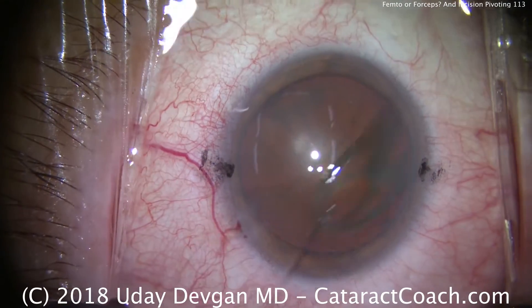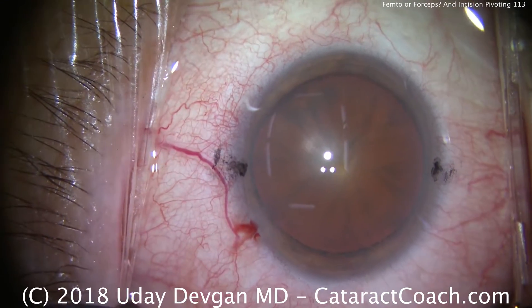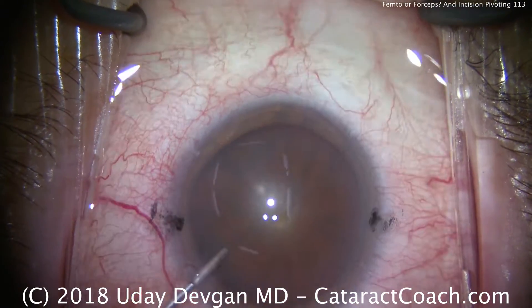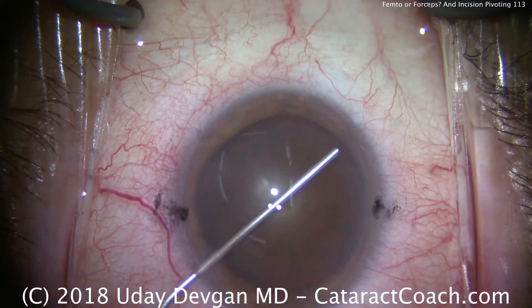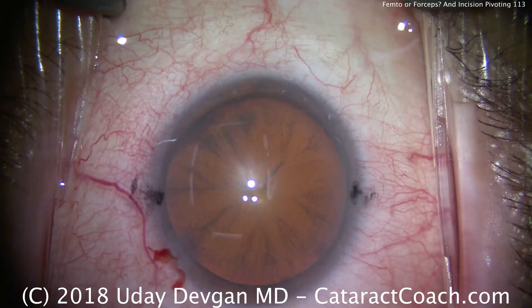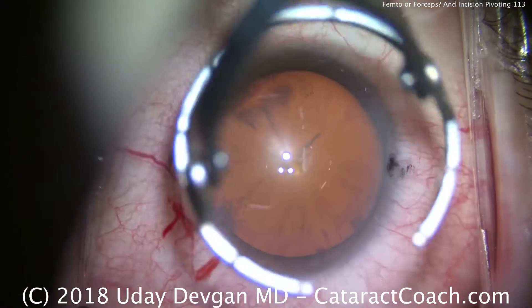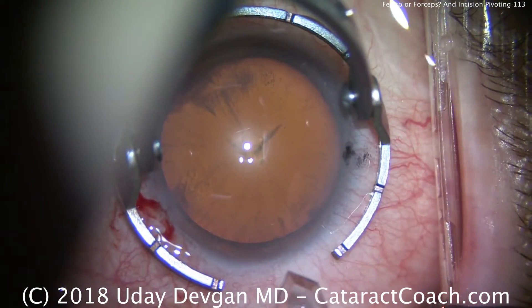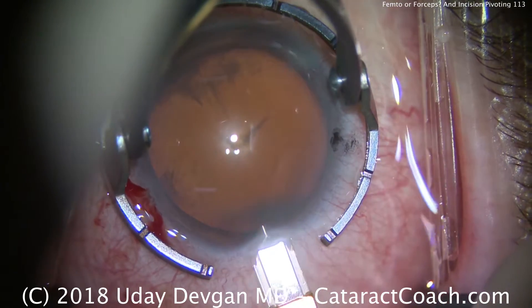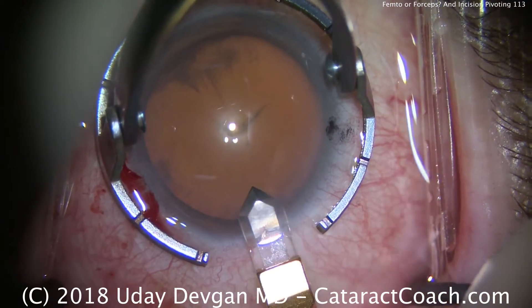In this case, we've just put anesthetic inside the eye, and we're going to fill the anterior chamber with viscoelastic. Watch how the cannula goes inside the eye — it goes across. Notice it doesn't touch the corneal endothelium, doesn't touch the lens capsule, and we get a nice big fill of the anterior chamber. The viscoelastic is important to deepen that anterior chamber so we can perform the next step: our capsulorrhexis.